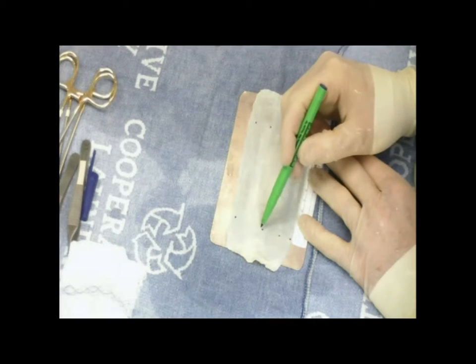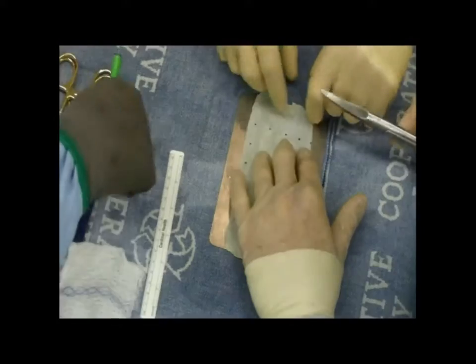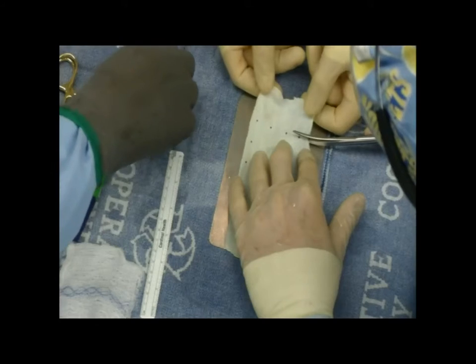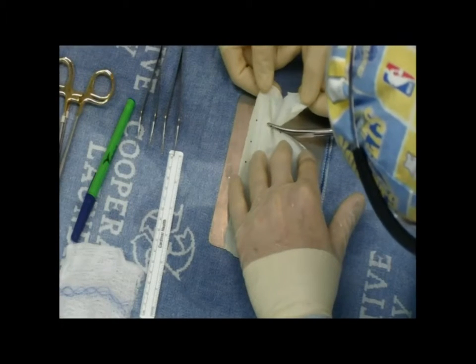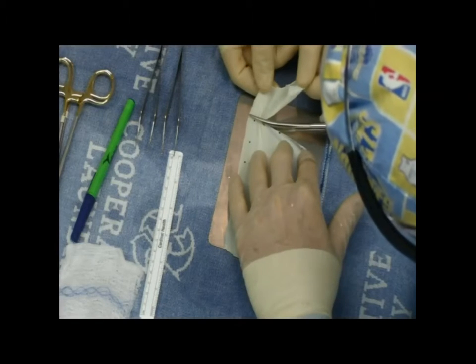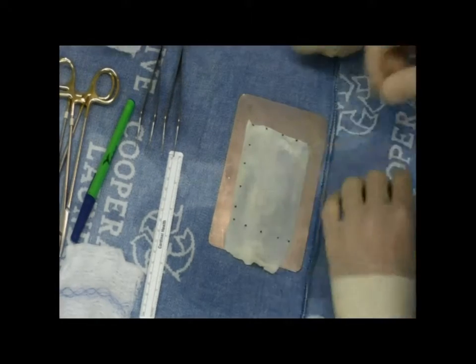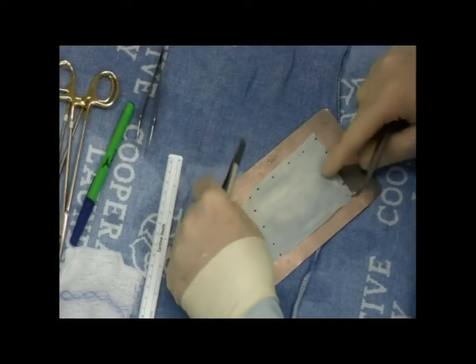You want to look at the shiny side of the graft to determine which section aesthetically is going to look the best once it's finally rolled. At this point, we're just trimming the excess graft to get our defined rectangle so that we can ultimately tubularize this to get a 5 to 6 millimeter diameter graft. The goal for me is 5 to 6 millimeters in diameter — this looks the best and it seems to work the best as well.